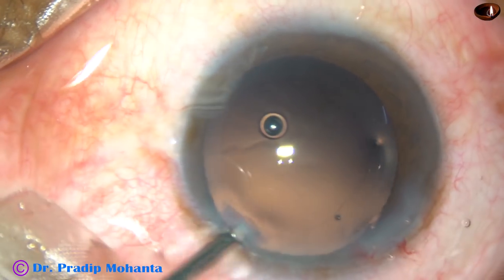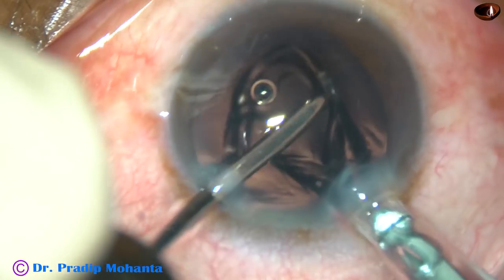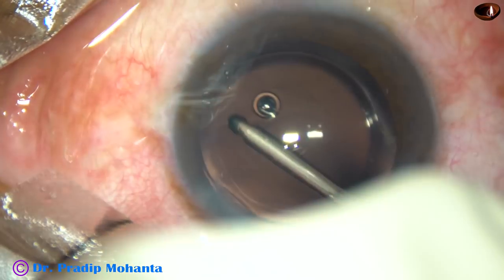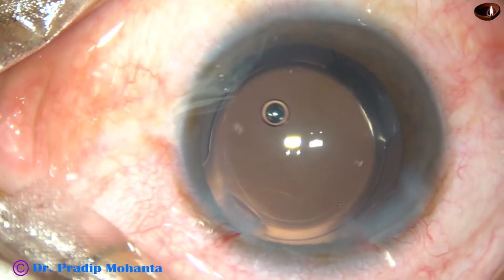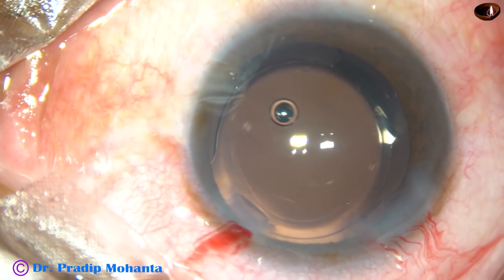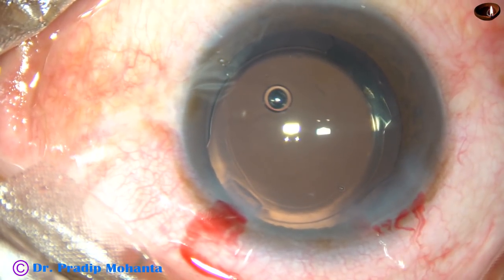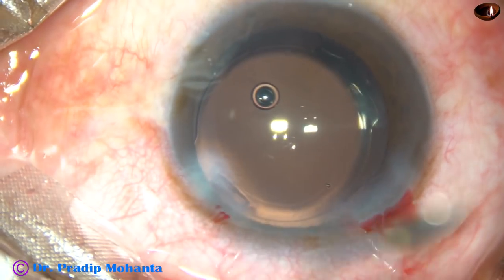And now, this is hydro-implantation. The anterior chamber is kept formed by irrigating fluid and the lens is placed in the capsular bag. This is a hydrophilic acrylic single-piece monofocal intraocular lens. You can see that the optic of the lens is covered in most of the area by the anterior capsular rim.